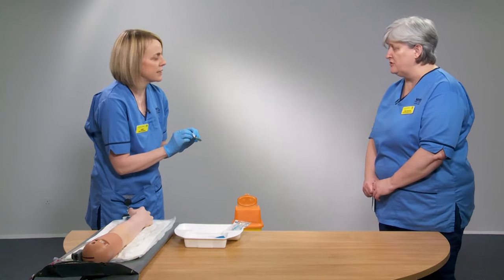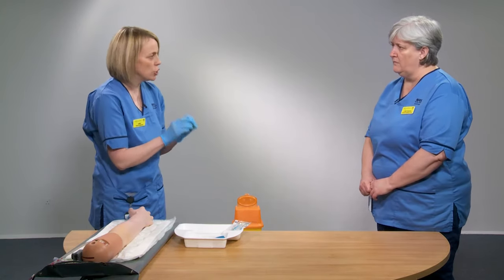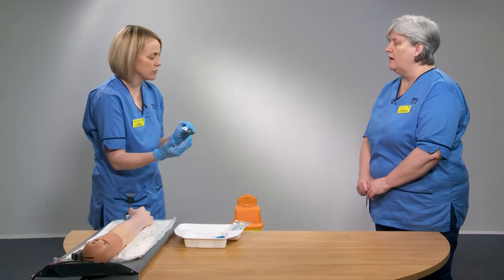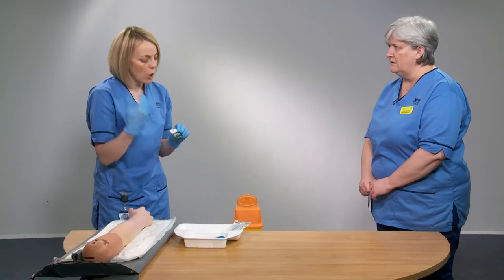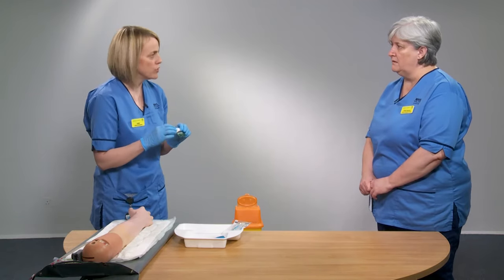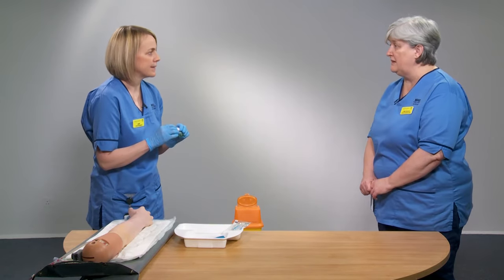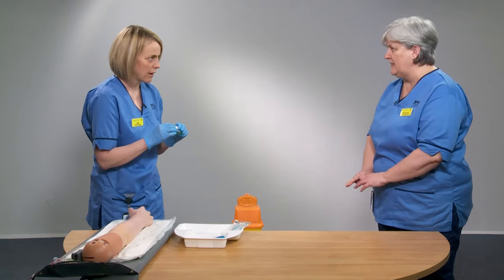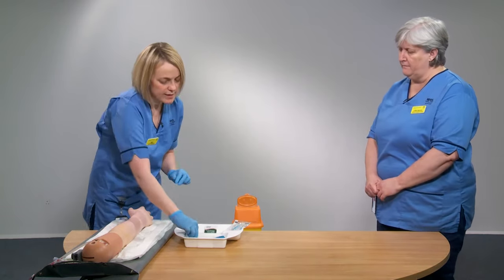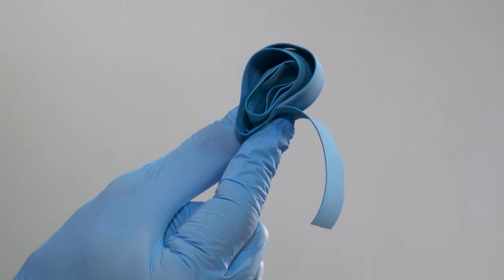We use a Clinell wipe with chlorhexidine within acute services, as we use these wipes for most of our clinical skills. However, since the device is not staying in and will be removed, alcohol wipes can also be used — the key requirement is 70% isopropyl alcohol. You'll also need a gauze swab for when the needle is removed, and a tourniquet.